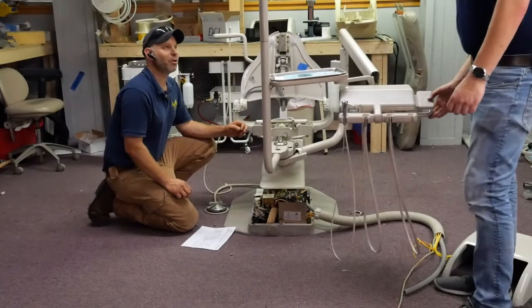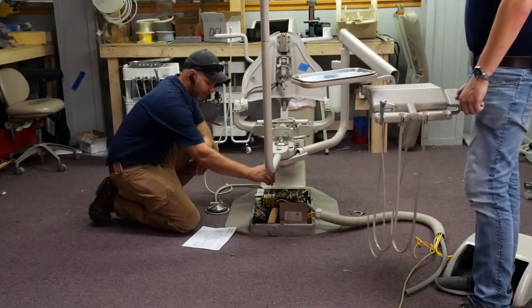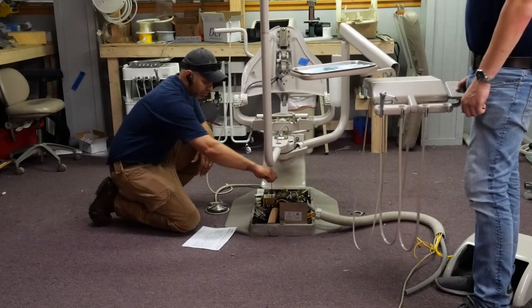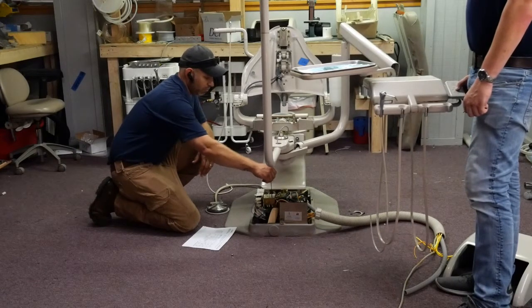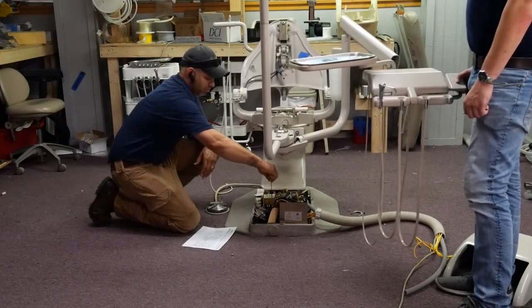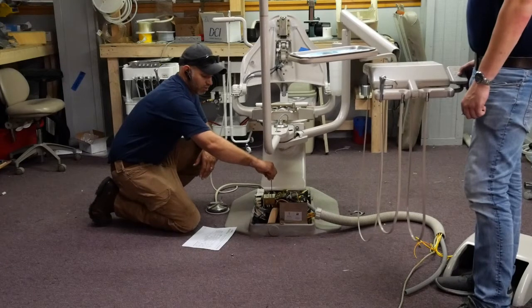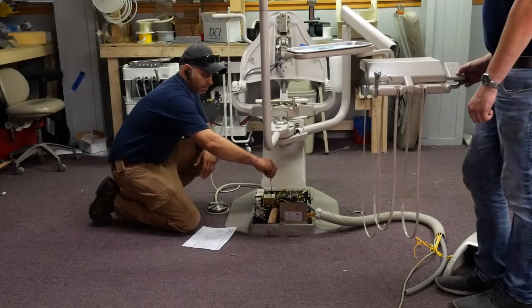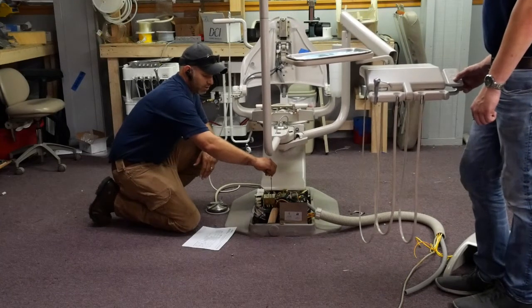Dance with the chair. Whoa. All right, so the first function we're going to be messing around with is the base up. Now, I'm going to turn it clockwise. Ooh, all right. Nothing. All right, see how it's lower? Now, go ahead. Ooh, all right. Gotta go back down real quick. Oh, hang on. Okay, so go ahead and activate base down.